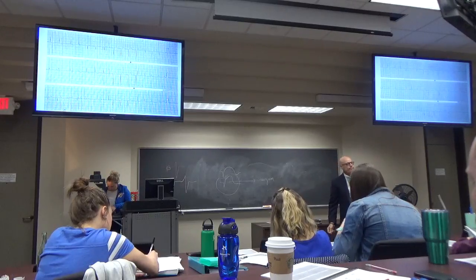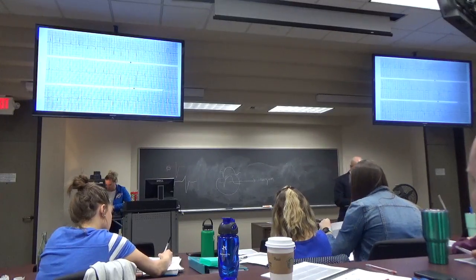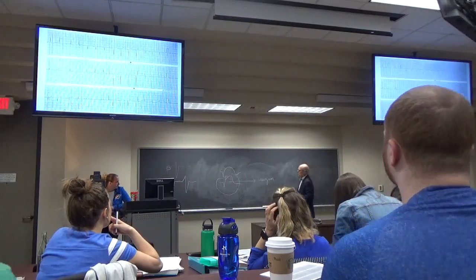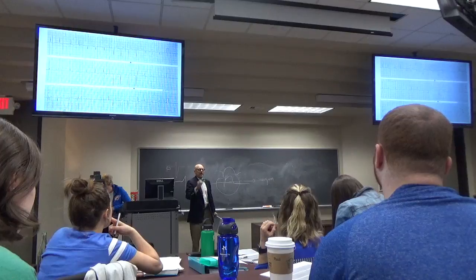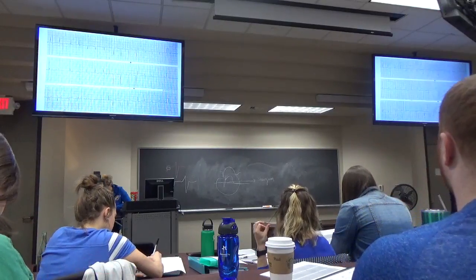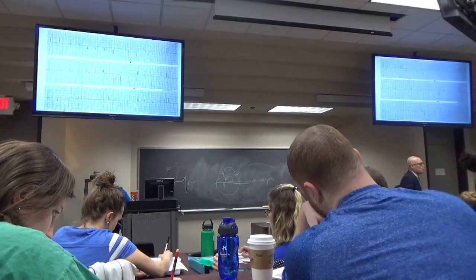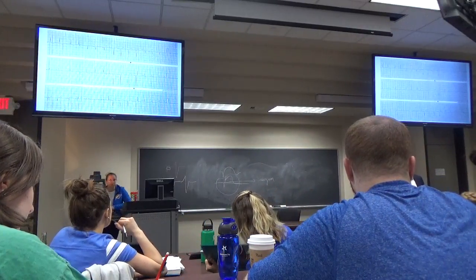So when there's that little flattening out right before it does the hump, you're saying aneurysm. That's the difference. It's that little kind of notch right there. Oh, no, it's not the notch. It's that the notch is elevated. The notch is elevated. Yeah. So see that sharp place, here's the baseline. That sharp point is when depolarization quit and repolarization started. That's defined by the J point. It's elevated, the ST segment is concave, and the T wave is upright. It looks old to me.